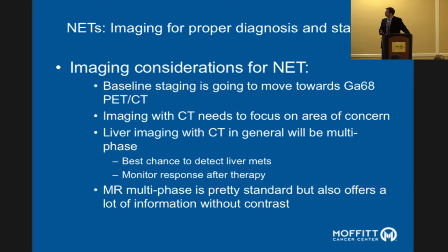So, specific imaging considerations for neuroendocrine tumors that you're going to run into: more and more, the baseline staging imaging to figure out where all the sites of disease are is going to move to gallium-68 PET-CT.